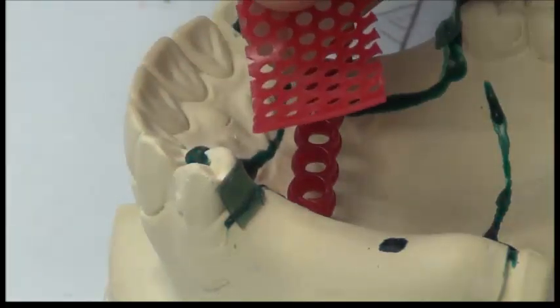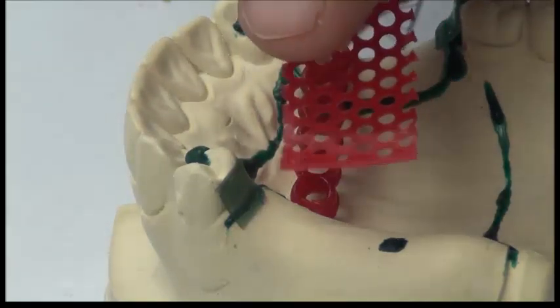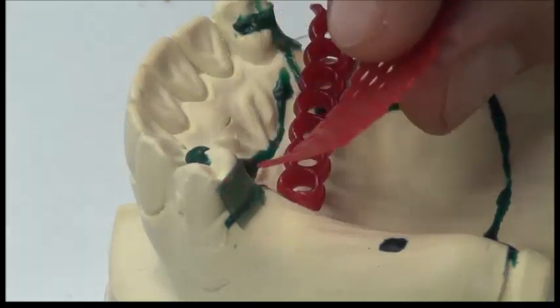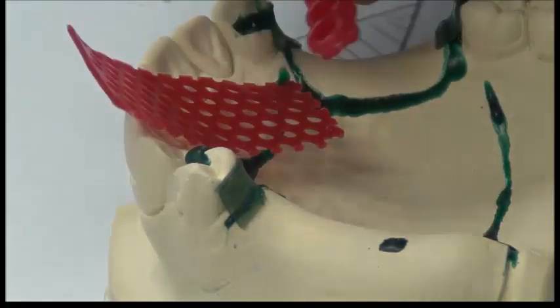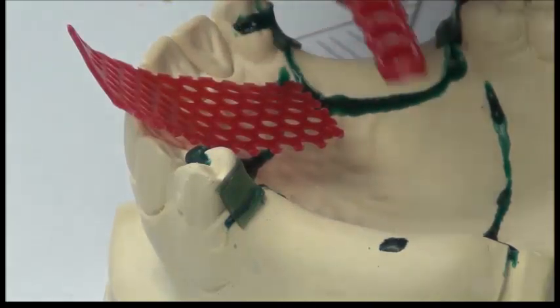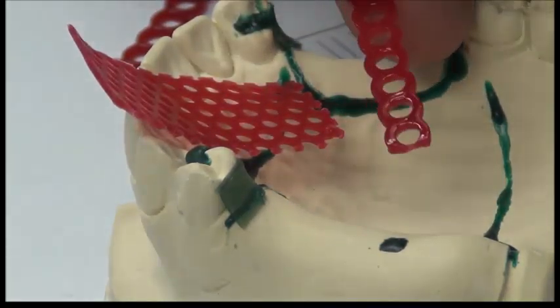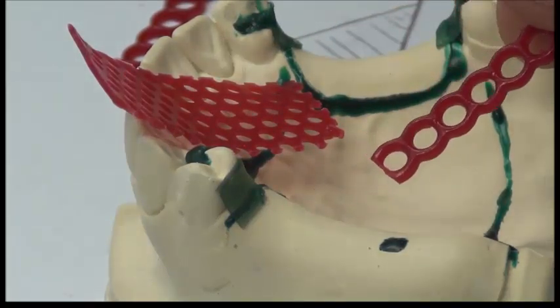These two, first of all, before adding them, we need to know their surfaces. We have a shiny surface and we have a bulging surface with the morphology on it. The shining surface is the one that goes on the tissue. The bulky one, or the one that has the morphology in it, we put towards the teeth. So if I have this, you can see there is a shine. Can you see it? It's shining on one side. On the other side, it has the morphology of the metal.